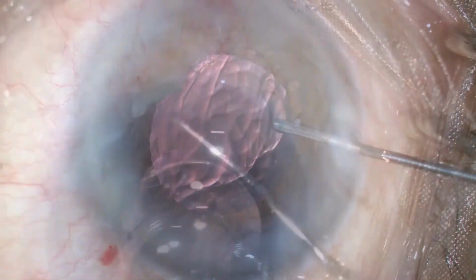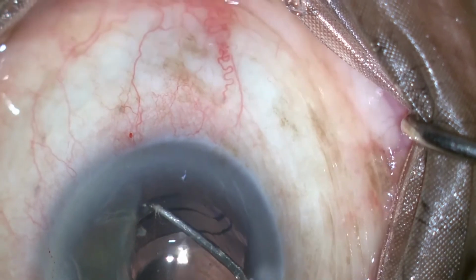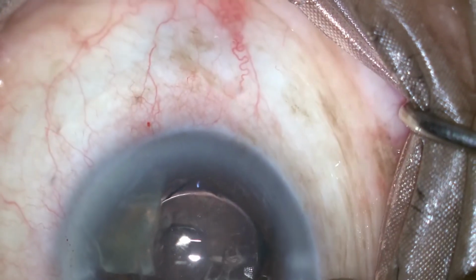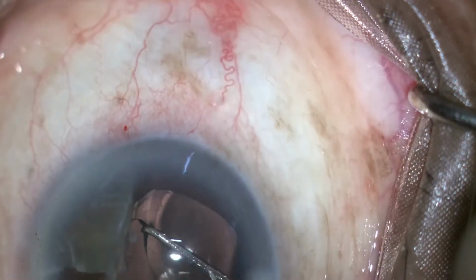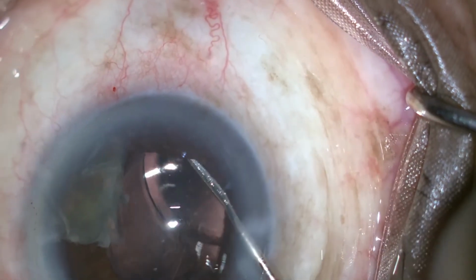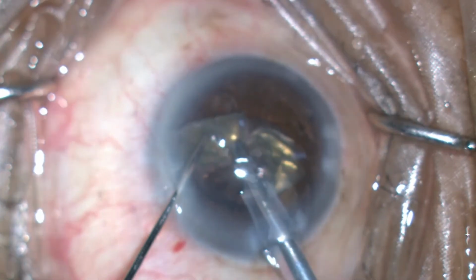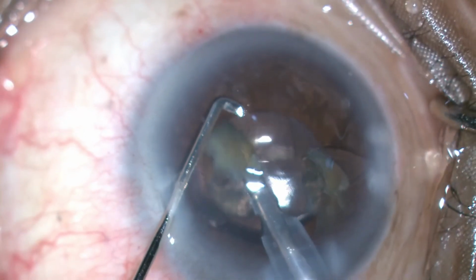So in this case, I could manage to implant the original planned single piece IOL in the capsular bag with some maneuvering. Once the IOL is put, the last fragment can easily be emulsified.